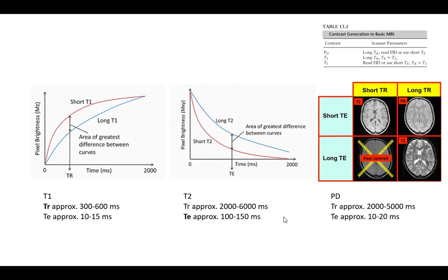Yeah. So I'm a little confused why we need a kick to measure proton density if we're not measuring T1 or T2 contrast. Because you don't want it to correlate to either of those times. Okay. But you still need a signal. If you don't kick them at all, they're completely random, so they all cancel and you get nothing. So you have to have some correlation, you just don't want them decaying. Okay. The only thing that matters is that there are just sheer different amounts of them.